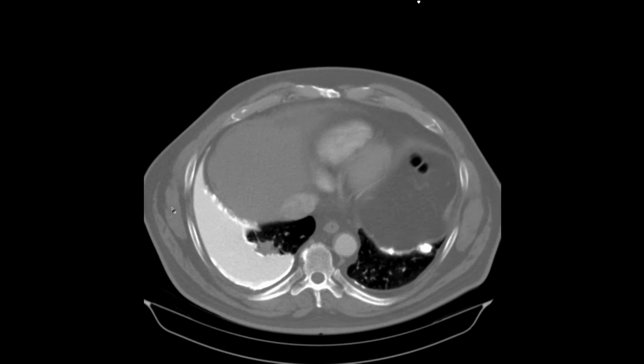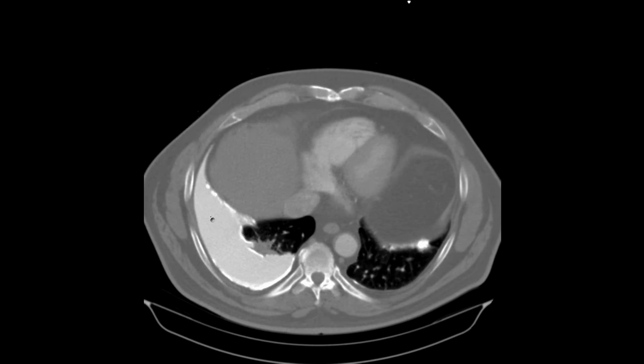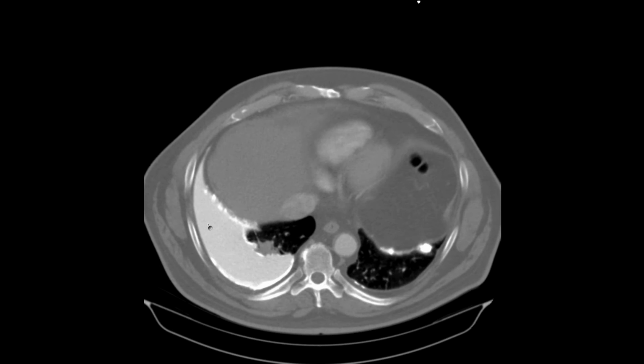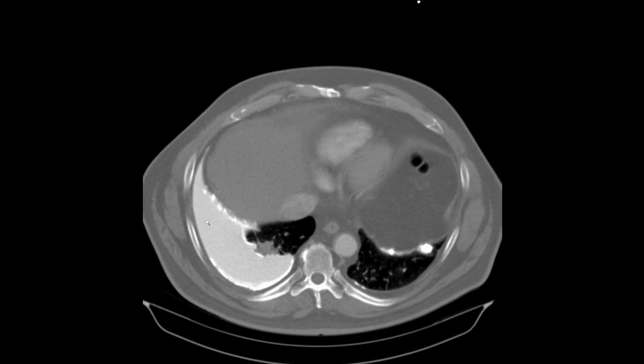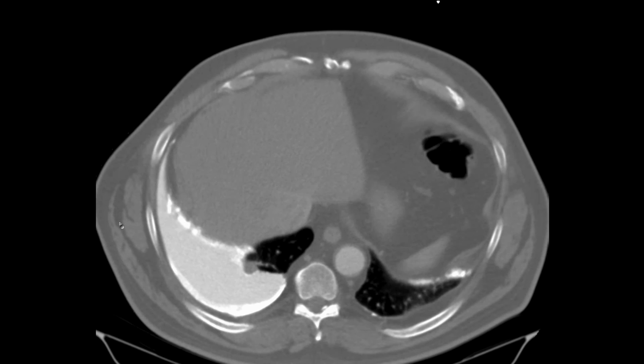So I started looking around. You can find case reports of, in a chronic pleural space, fat fluid levels and fat milk of calcium levels. Now, he does not have fat to form that, but that's attributed to chronic pleurisy. There are mentions of chronic tuberculous pleurisy. The notion of the fat, which he doesn't have, is pseudochylothorax, so it's thought maybe to represent fat from degenerated cells in the fluid, but a really nice example of a milk of calcium basal pleural space.